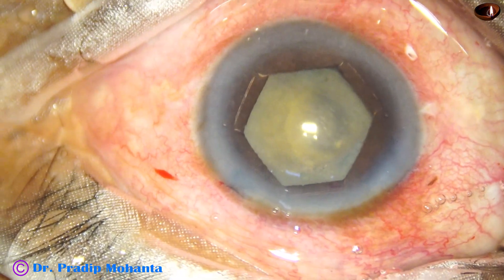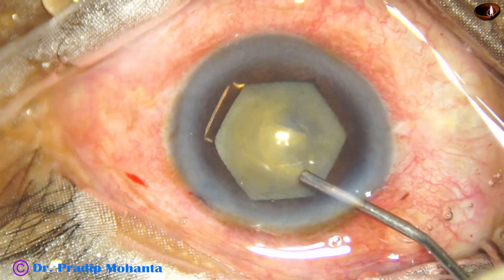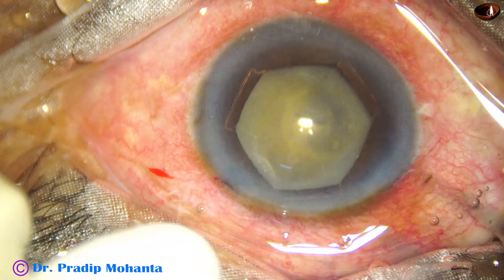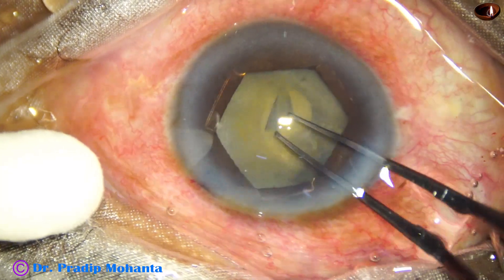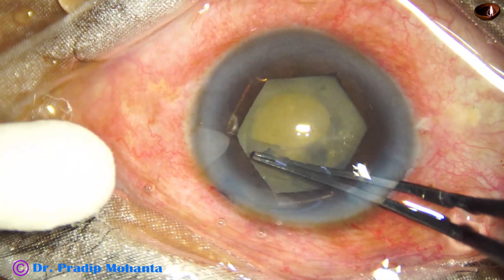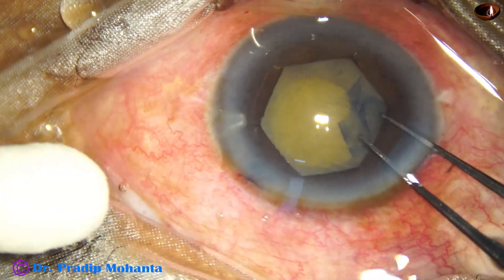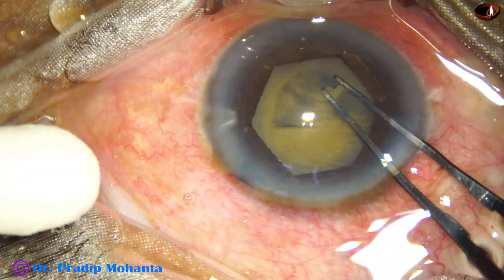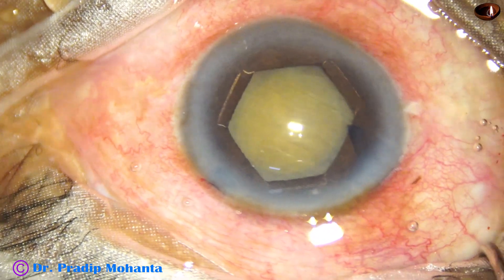The anterior chamber is nicely filled up with viscoelastic, and then the utrata forceps is used to do an optimum size rhexis. My plan is to do a rhexis of about 5 millimeters. I go all around very gently, flipping the anterior capsular flap — and here it is, the rhexis is done.